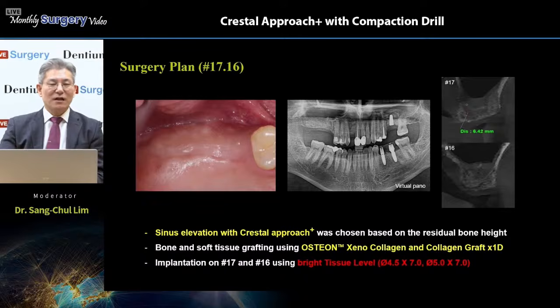Especially today, Dr. Chung shows us this new technique. The name is Crestal Approach Plus. Crestal Approach Plus means here using the osteon, xenocollagen, and collagen graft too. What is the detailed process?